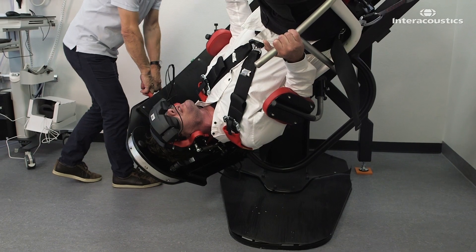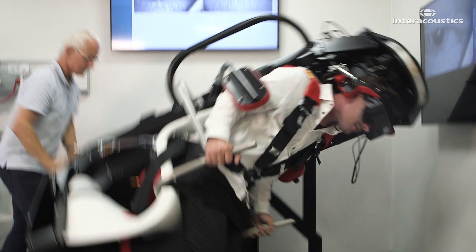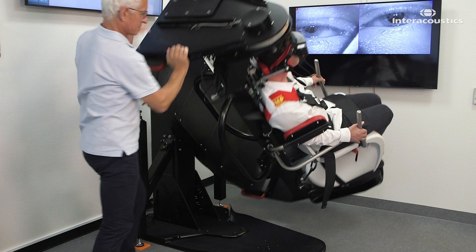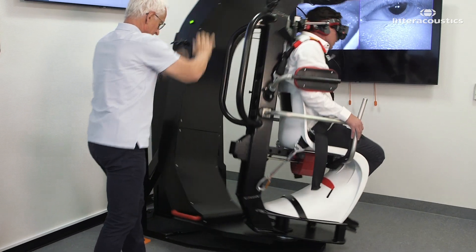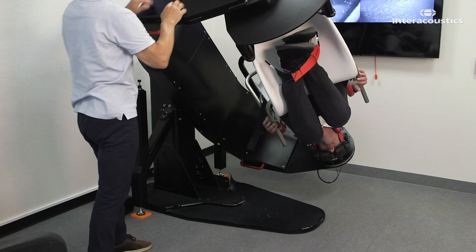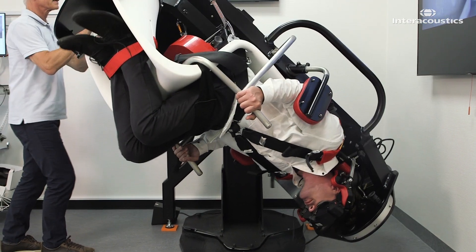Then lift and swing the chair with the patient all the way around to the opposite side. At the completion of the 270-degree turn, the chair decelerates rapidly against the shock absorber on the opposite side. Continue to apply three rapid decelerations in this position.